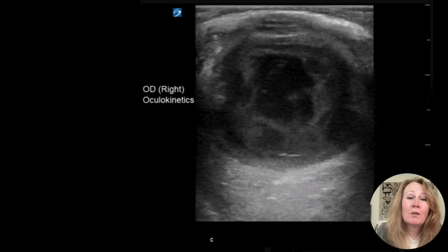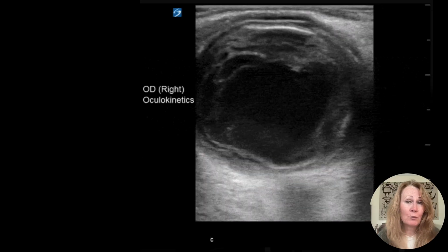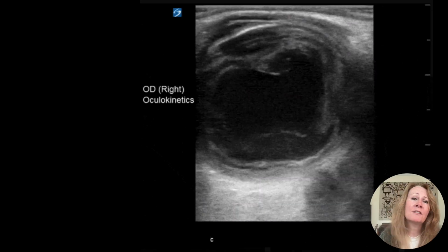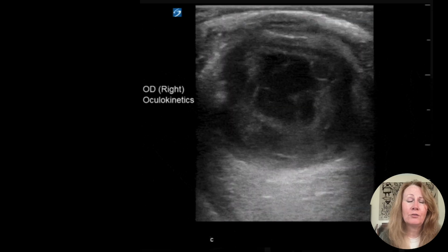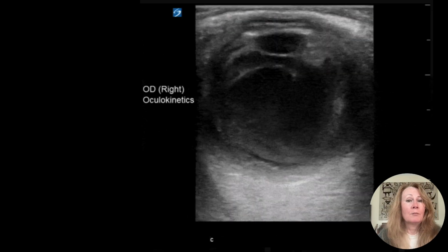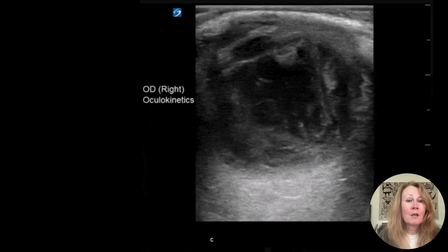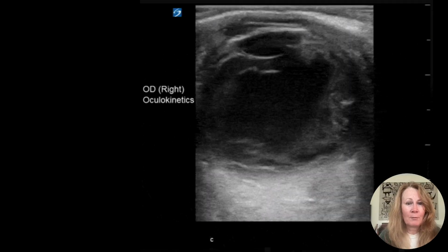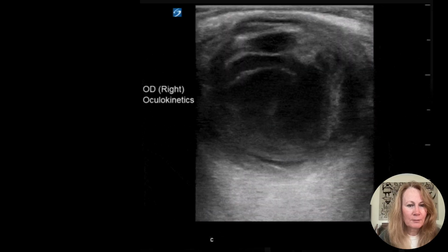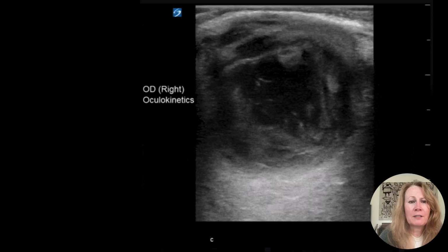Now we move on to our POCUS exam of the eye because our patient is complaining of eye pain with movement and decreased visual acuity. We can't assume that this is related to our suspected diagnosis of endocarditis because patients can present with more than one problem. So when we look at our POCUS exam, we have to look at just this exam objectively. What do we see, and not bring any other subjective thoughts into it. So we'll take this apart.